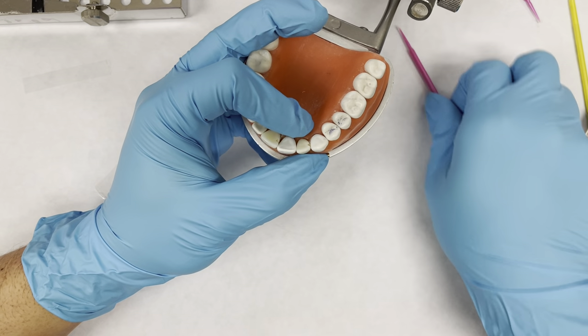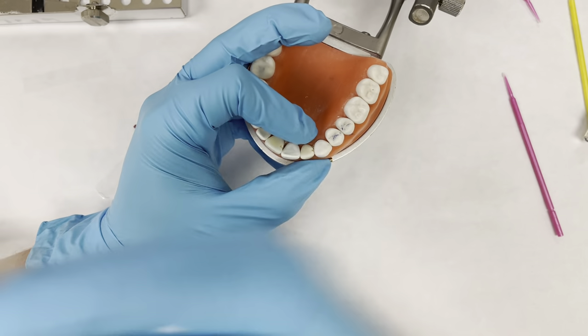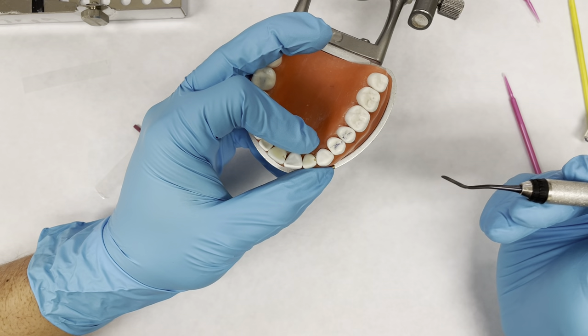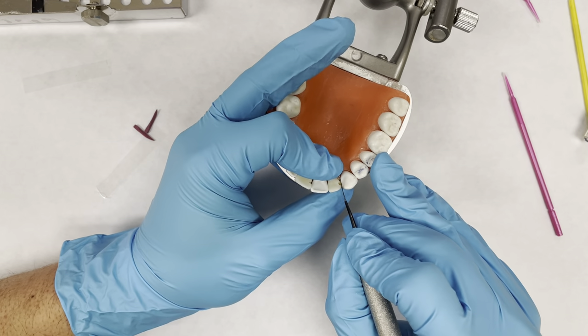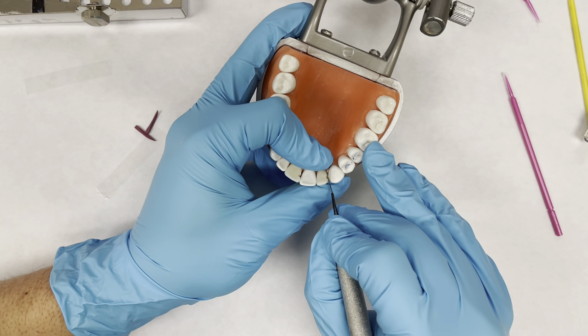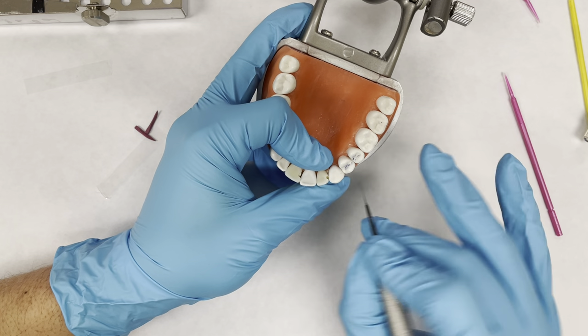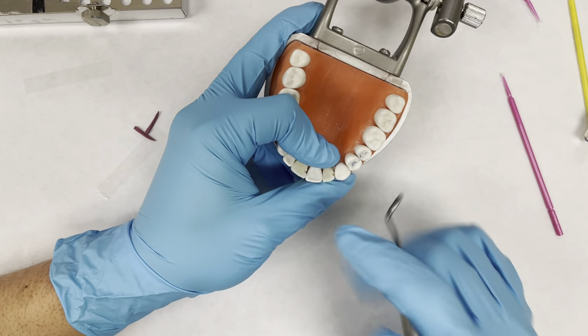If you don't have fingernails or if you don't have time to use a micro brush, you can use your plastic instrument, but it's not recommended because you can bend it. Just put it right in between, make sure it stays perpendicular to the gingiva because you don't want to be bending it either direction. Then you can put a little pressure, create that separation, and then pop the rubber dam.